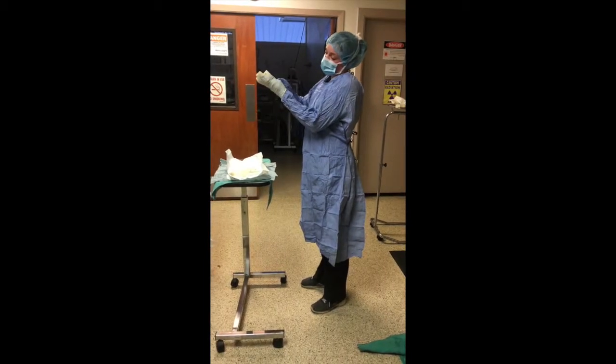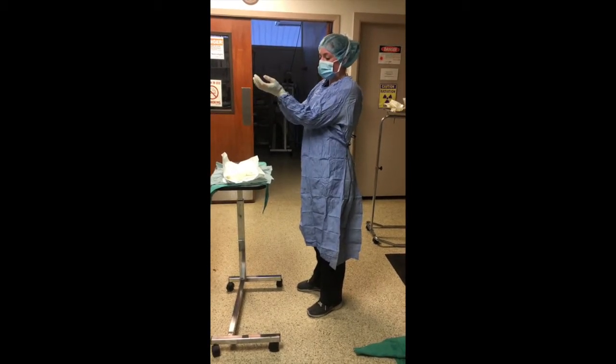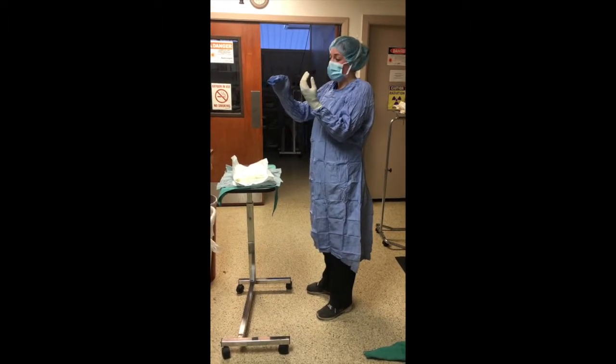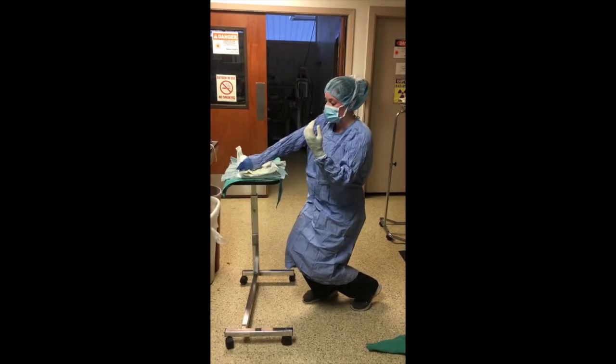Once I've done that, I can grab the glove and the gown and advance my hand into it. I can adjust the glove, still making sure that my other hand is secured, mitted inside my gown. Once I've done that, I can go ahead and grab my next glove.